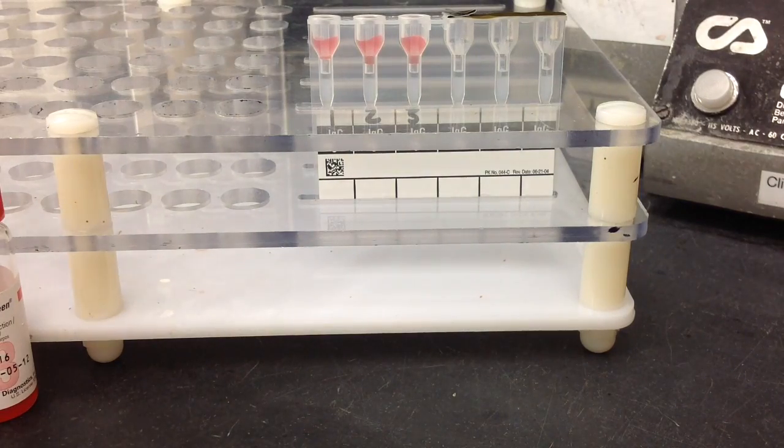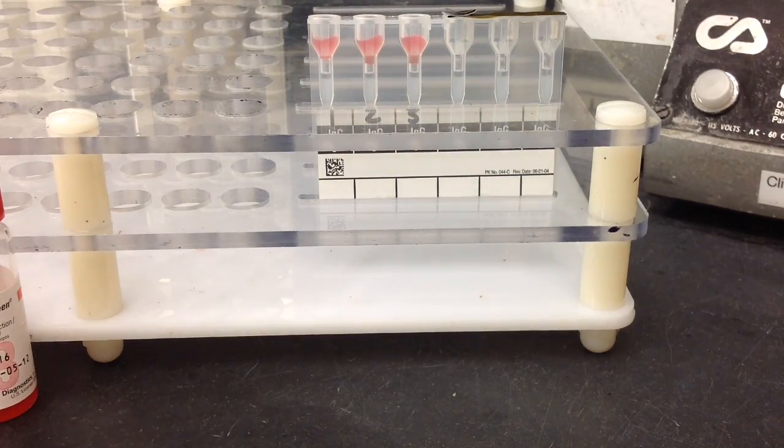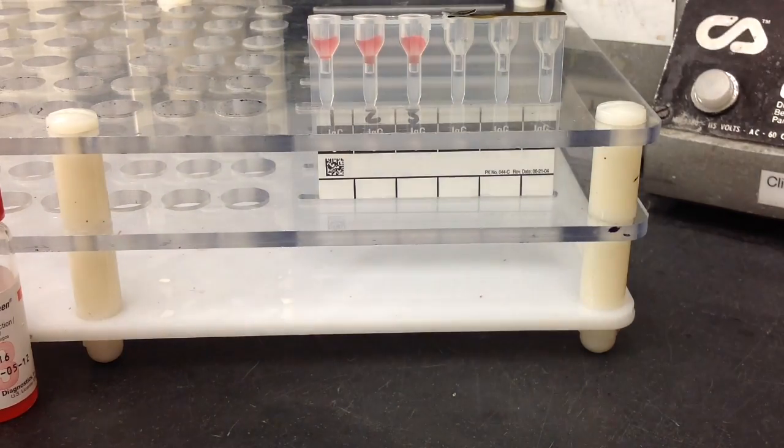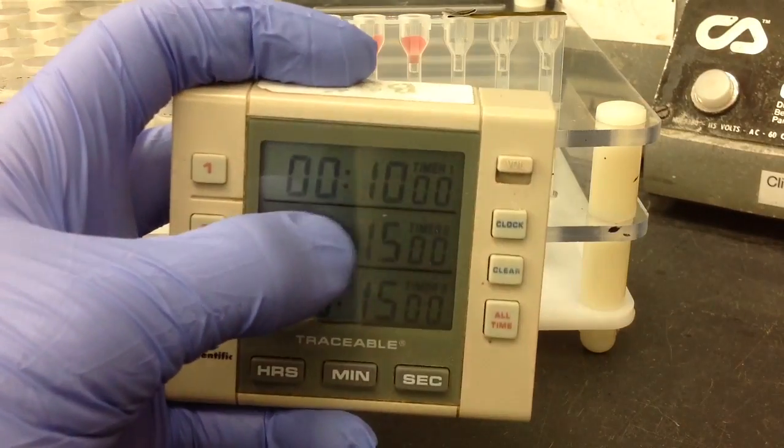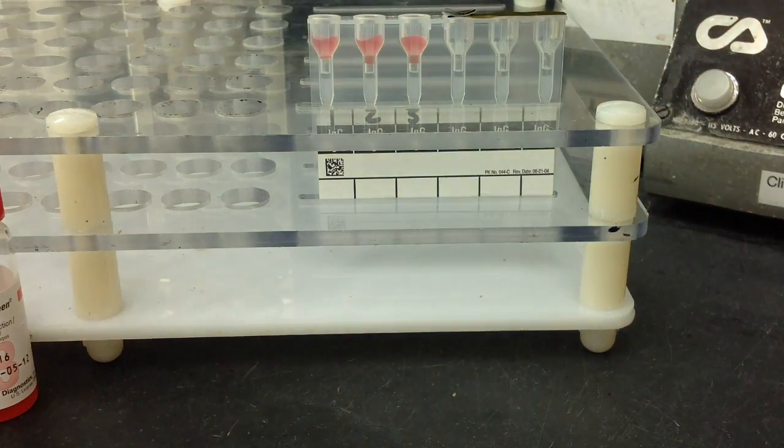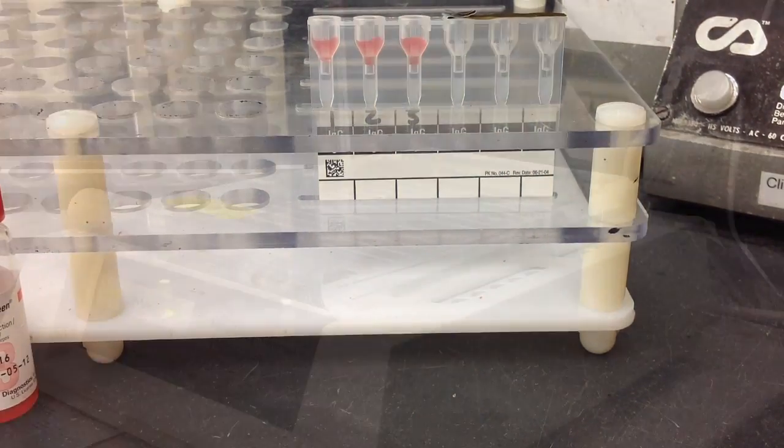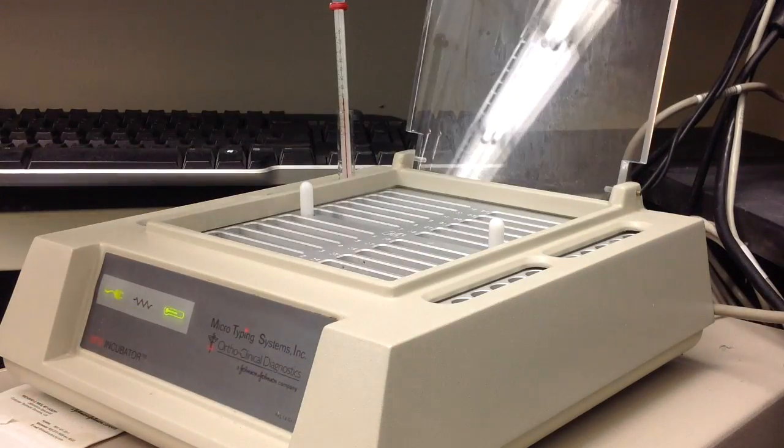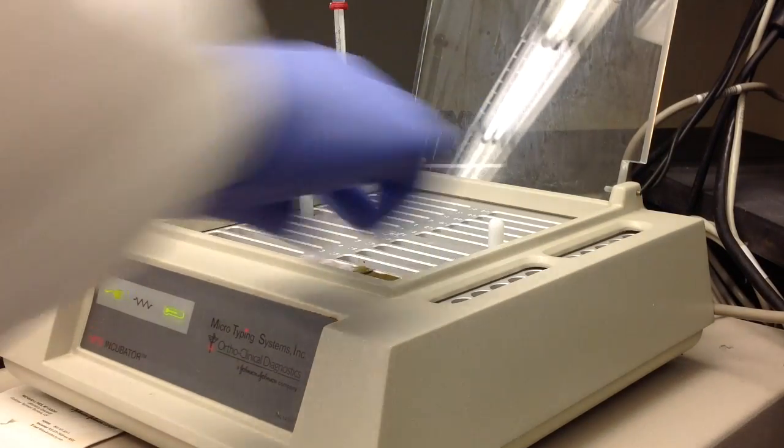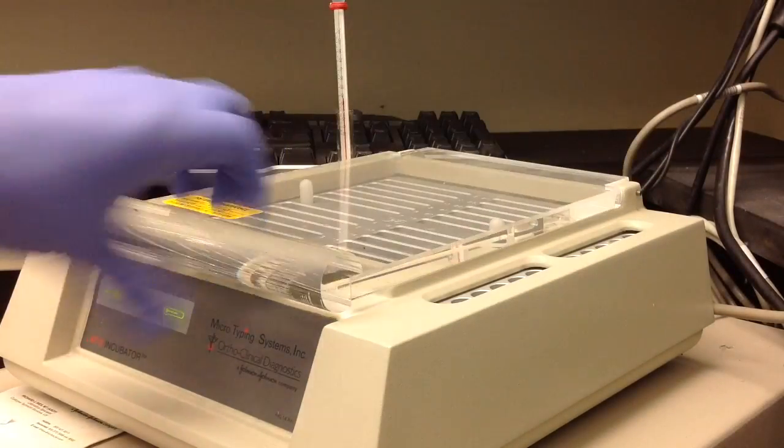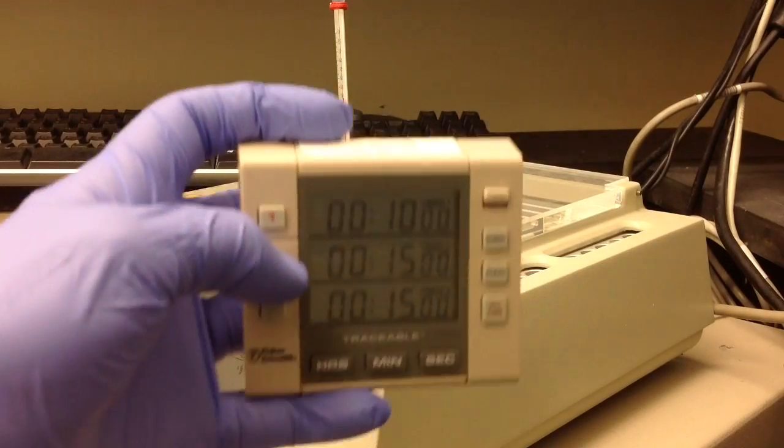Once you have your patient's plasma mixed in with the reagent red cells you're going to incubate it for 15 minutes in the Micro Typing Systems incubator. You put the gel card in the incubator, close it up, and don't forget to set your timer for 15 minutes.